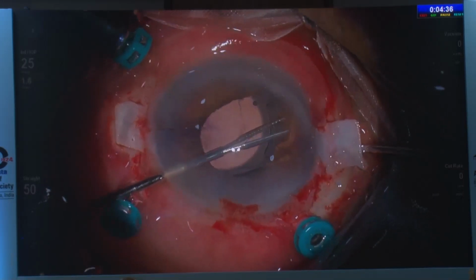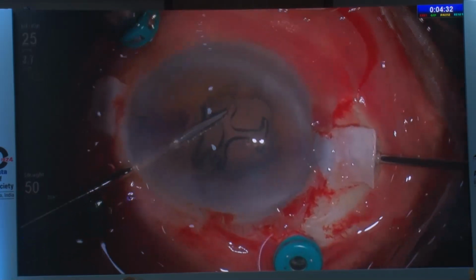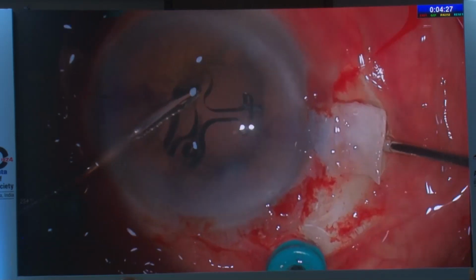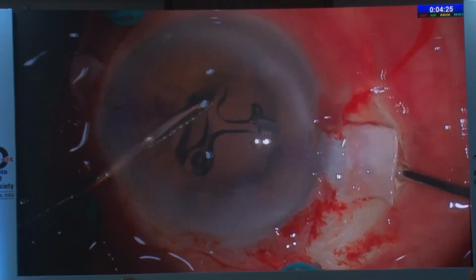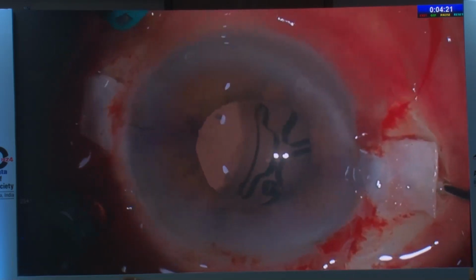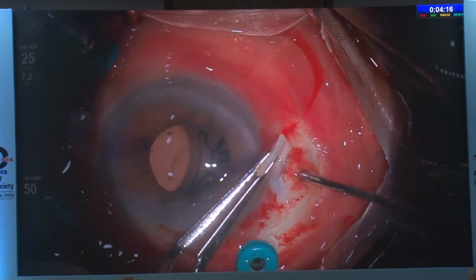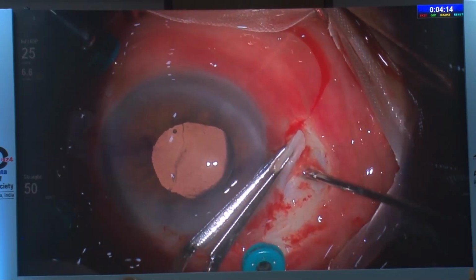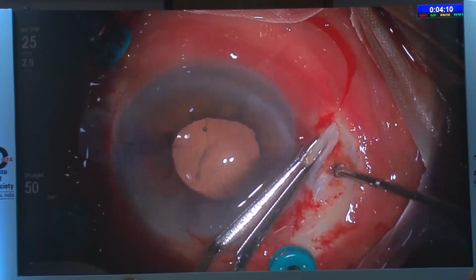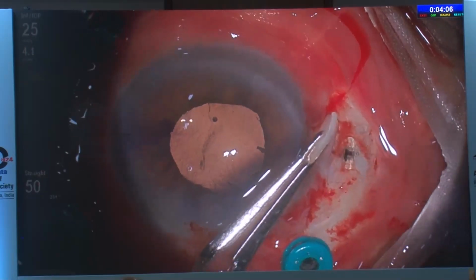haptic. This is the forceps number 2, which is used to hold this lens and bring it into the center. Now again, with the help of forceps number 1, you are going in through the sclerotomy, holding it, and then you bring it out. It comes out, unfolds, and sits in nicely.